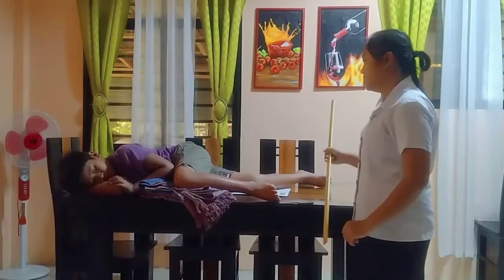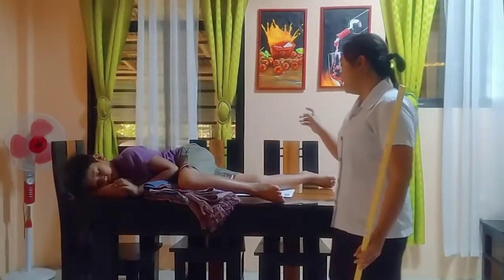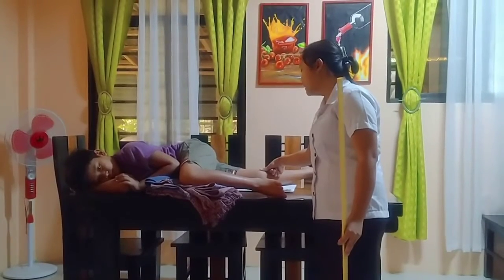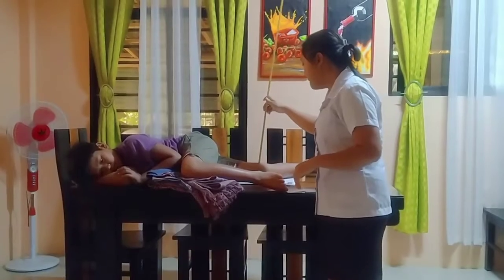Ayan. The central ray will be entering the 1-inch knee distal to the medial condyle. So, dito po siya papasok.